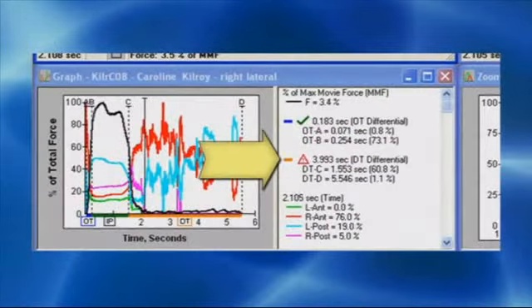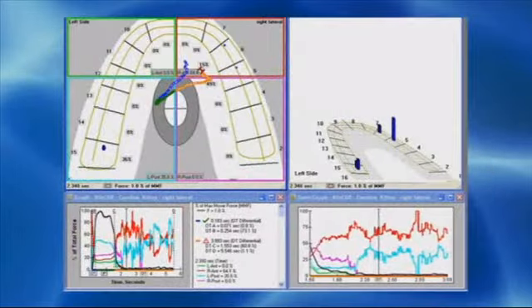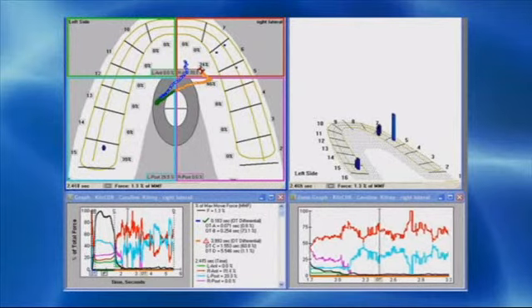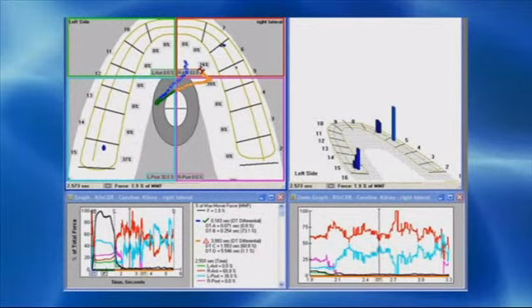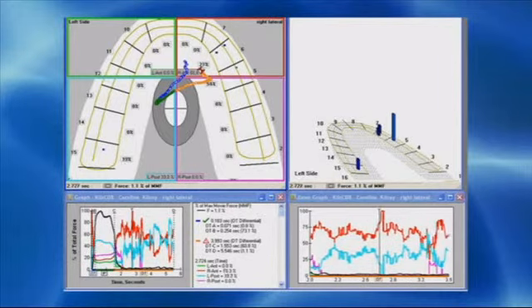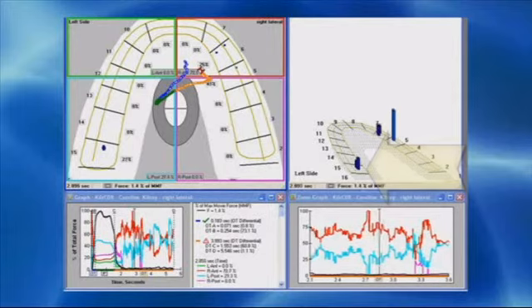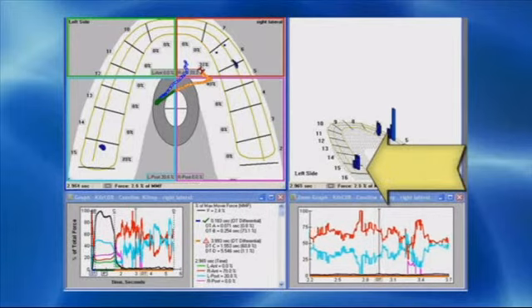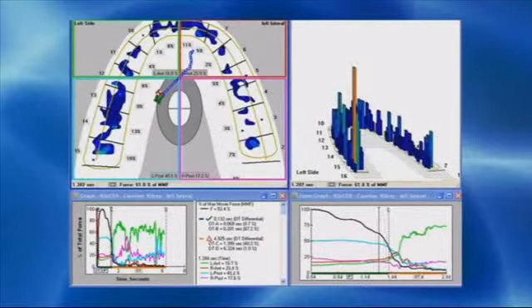In optimum occlusion, your back teeth should disengage in fractions of seconds, less than half a second. And that's the kind of thing that we can measure with the T-scan technology that's impossible to see by visual inspection. And so here, a goal would be to have your back teeth separated in less than half a second, and you're dragging your back teeth together for a very long period of time. Actually, when you move to the right, your back left gets in the way and stays in the way during the entire movement. So let's take a look at going to the left.